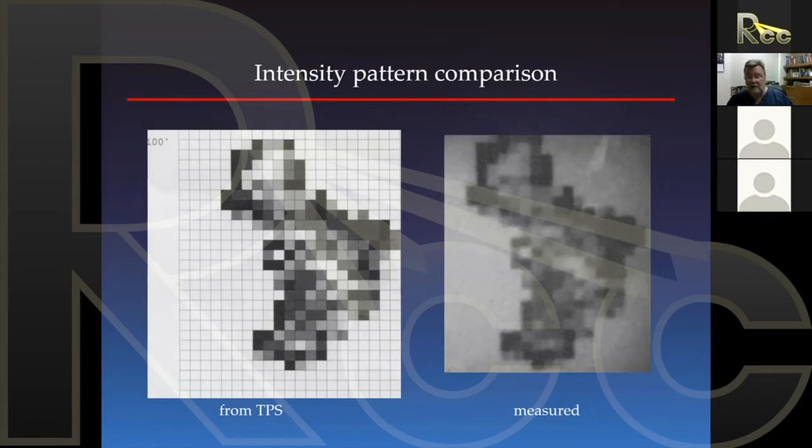If your ion chamber measurements were good, this would give you a sense of some spatial information that would say, yes, if I have ion chamber measurements in 1 or 2 areas, perhaps this would be enough to make me feel good if all of the beams were irradiated. This is a qualitative assessment, though, in this case. This is just telling us, yes, this one looks like that one.